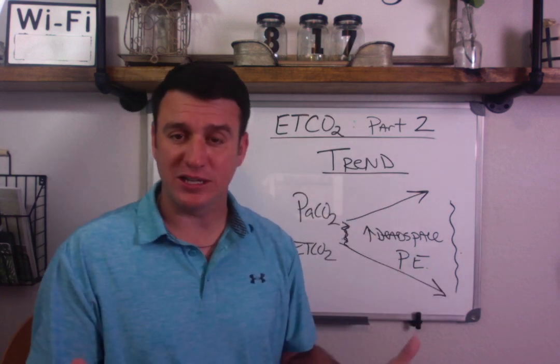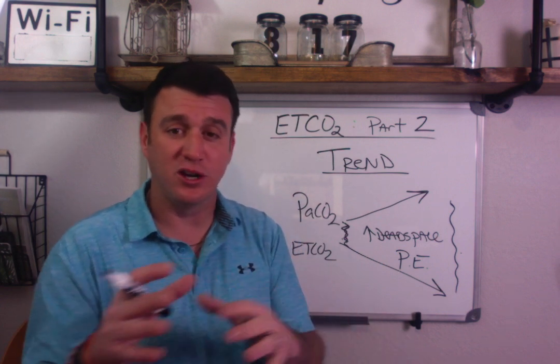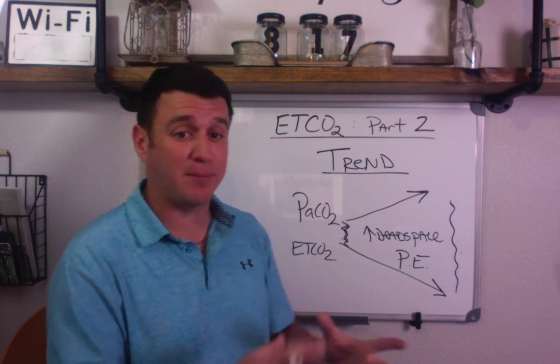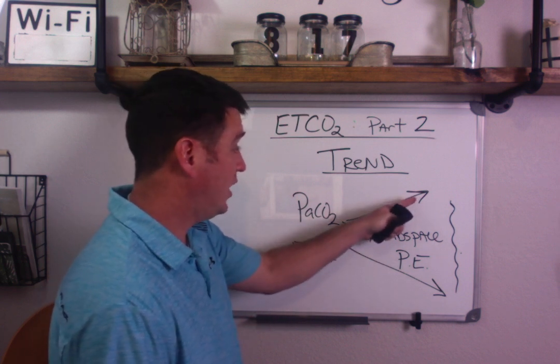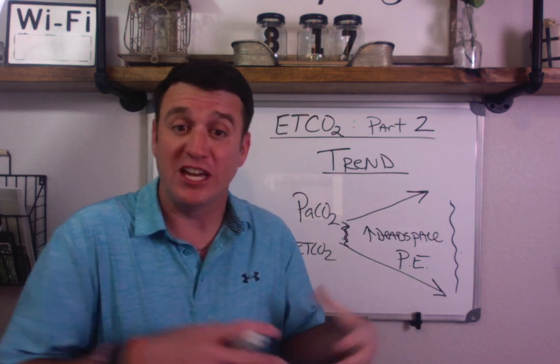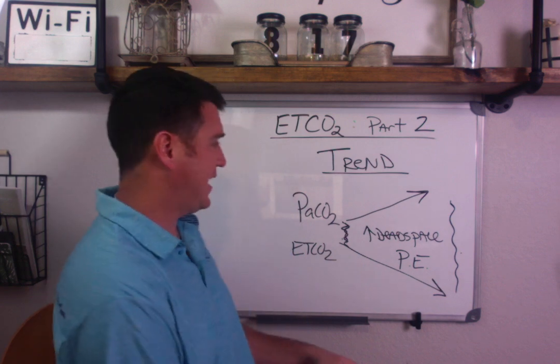And this is how we use it clinically. So you just have to understand what would cause an end-tidal CO2 to go up or down and be thinking about those things. Now, this is the oddball. A patient who throws a pulmonary embolism will cause your CO2 to go up, your end-tidal CO2 will go down, your gradient will get larger. Why is this? This is what I want to focus on now, okay?